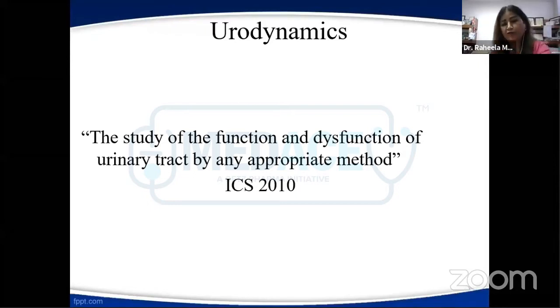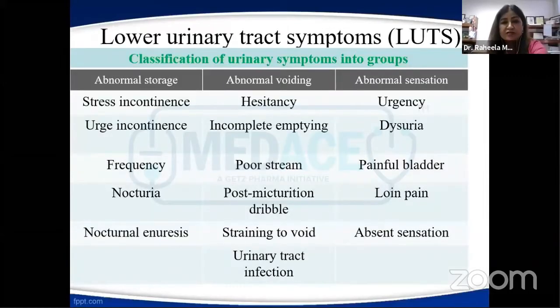So basically, urodynamics, as the ICS defines, is the study of function and dysfunction of the urinary tract by any appropriate methods. By any means, there are many methods which comprise the urodynamic studies. And why do we need various methods? Because there is a spectrum of symptoms that the patient presents with. It is not just incontinence alone.